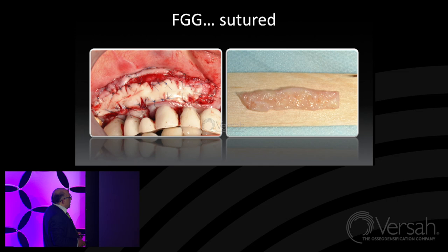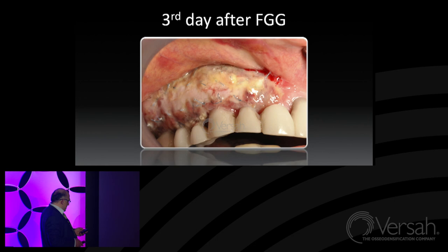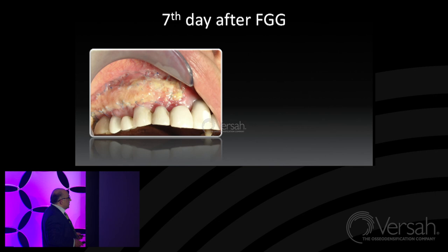Let's see what we have at the third day. This is the view of the third day. You see that it's covered with fibrin, some layer, and the process of degradation of superficial layer of this free gingival graft already begins, but we hopefully see what we have at the seventh day, a little bit better, but still we want to see totally another view.